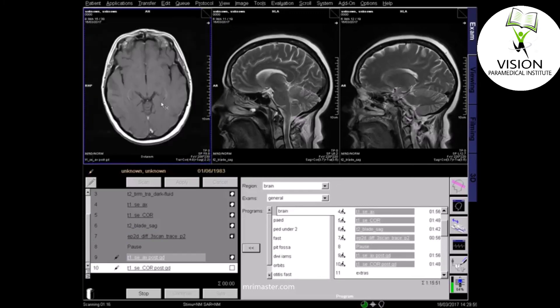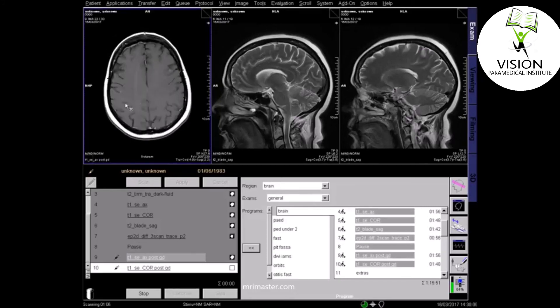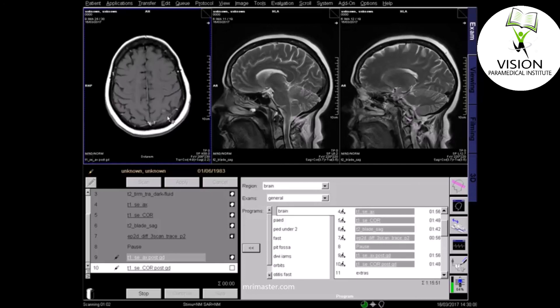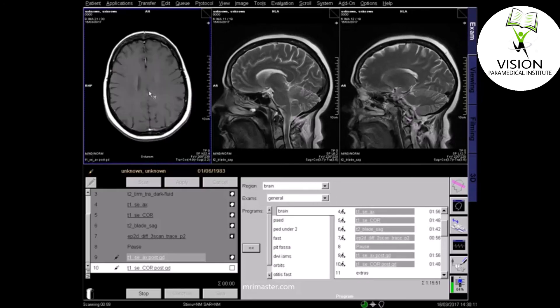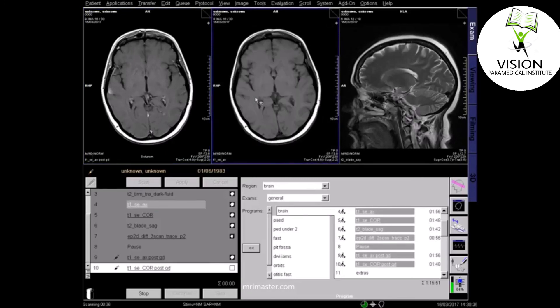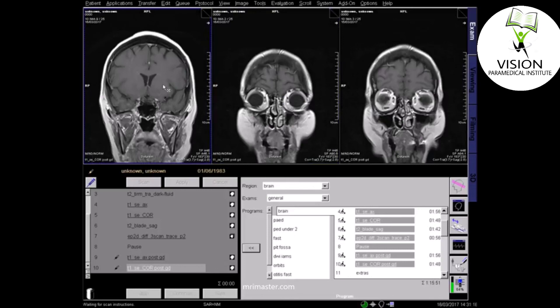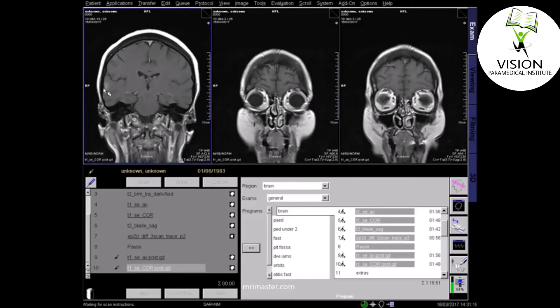On the T1 post-contrast axial sequence, you can see multiple enhancing lesions in comparison to the T1 non-contrast axial scan. On the T1 coronal sequence, the lesions are again visualised as bright areas.